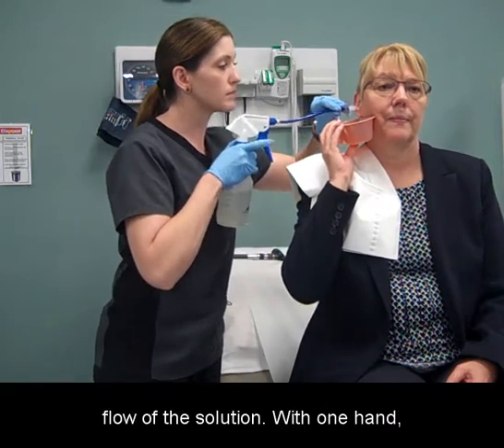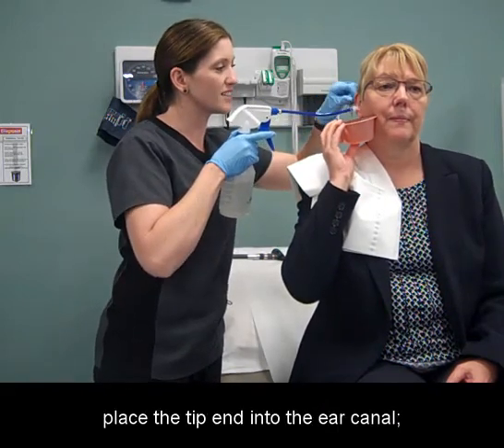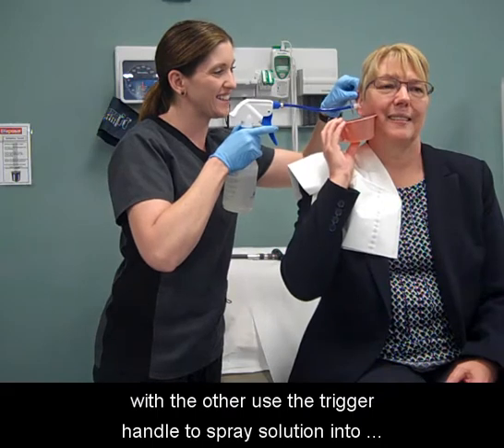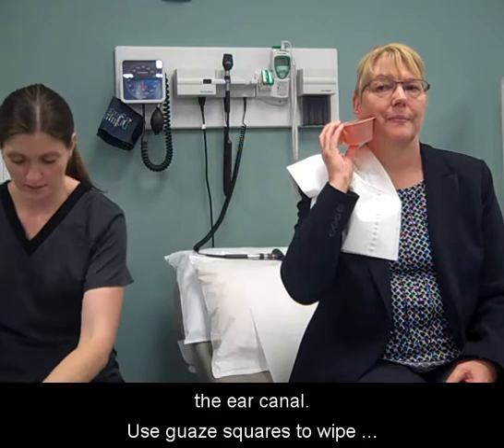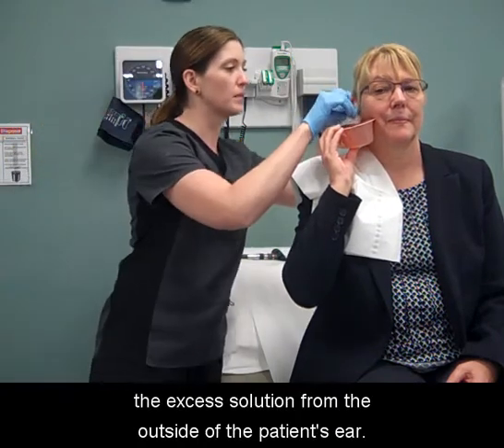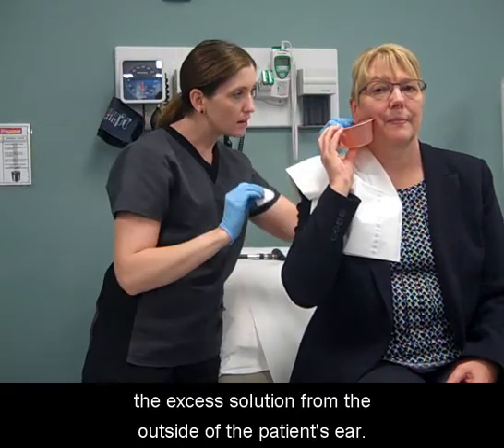Use two hands to direct the flow of the solution. With one hand, place the tip end into the ear canal. With the other, use the trigger handle to spray solution into the ear canal. Use gauze squares to wipe the excess solution from the outside of the patient's ear.